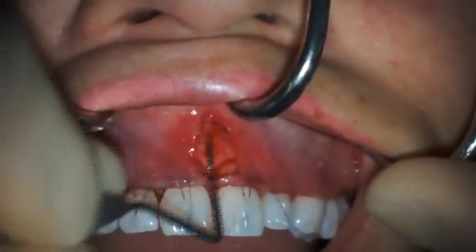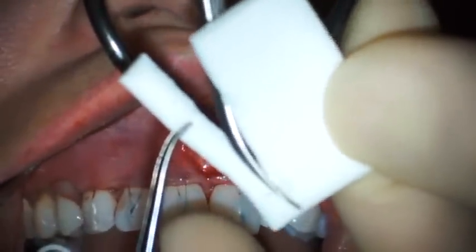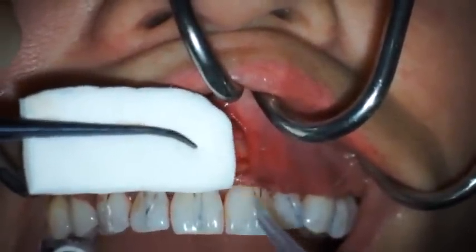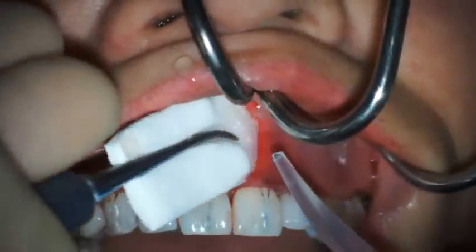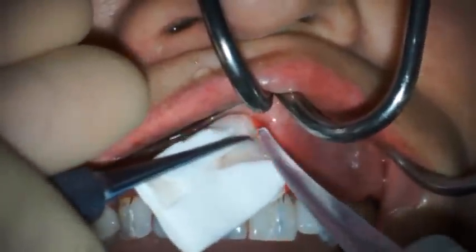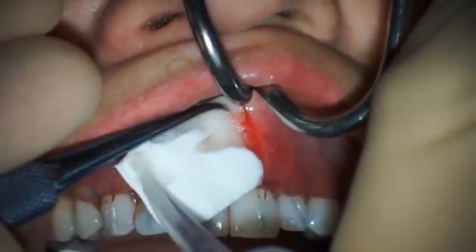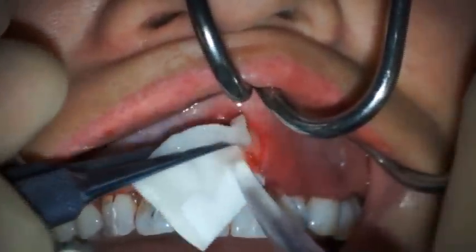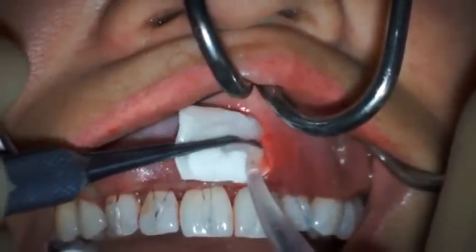The depth of the vestibule is measured, in this case approximately 15 millimeters. The mucograft matrix is properly sized to occupy most of the space within the subperiosteal tunnel. Using a tissue forceps to position the mucograft through the subperiosteal tunnel, mucograft is first lightly wetted with sterile saline. Although in other procedures mucograft is positioned dry, lightly wetting the mucograft in the VISTA tunneling technique facilitates smooth placement throughout the length of the tunnel. It is best to wet the mucograft immediately prior to placement inside the tunnel. Mucograft is next inserted through the midline access opening, the full length of the subperiosteal tunnel.